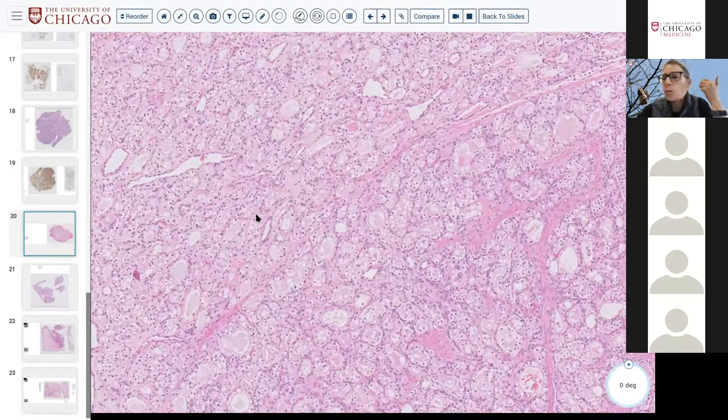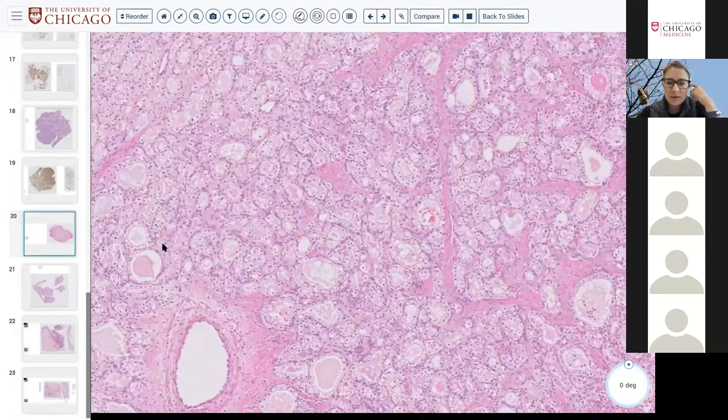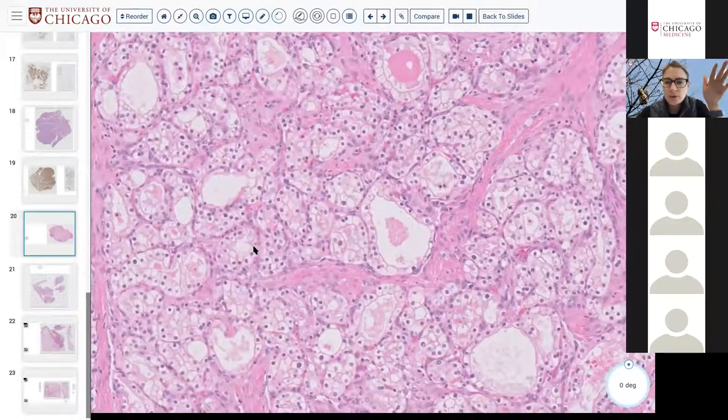Weirdly, there are a lot of tumors in the nose that can mimic other carcinomas, and these are two of them, intestinal and renal. I don't have them on this particular slide set, but I can give you examples of others that mimic Ewing's, that mimic adenoid cystic. The nose can do a lot of weird things, right? If you have any additional interest in seeing any of those mimickers in the nose, some of these very rare tumors, let me know. We can look at them, or if we have time at the end, I can pull up my other slide set.